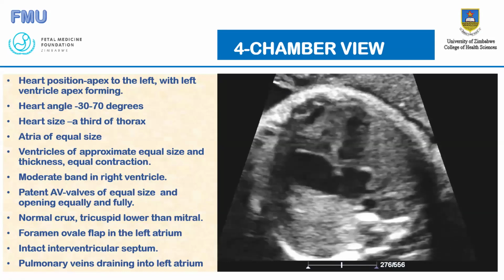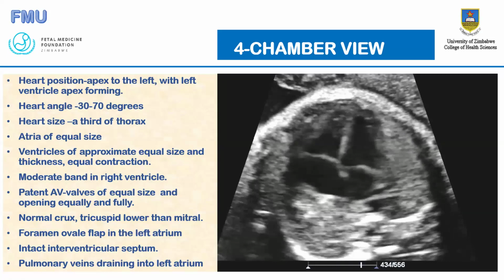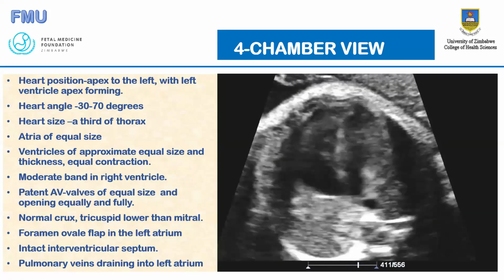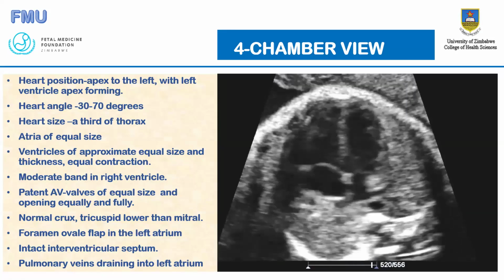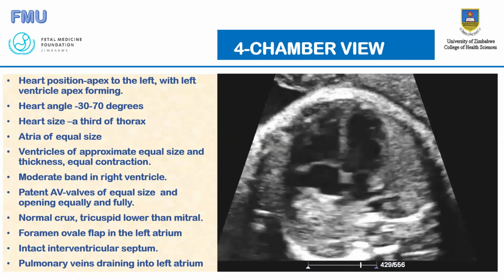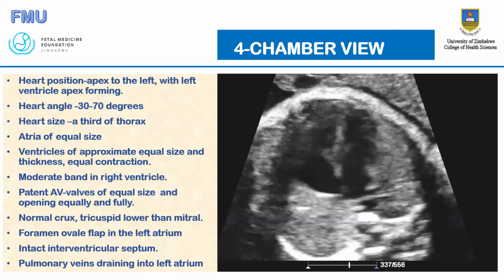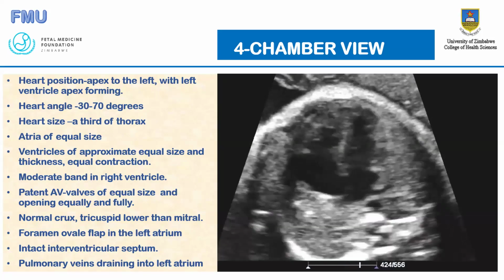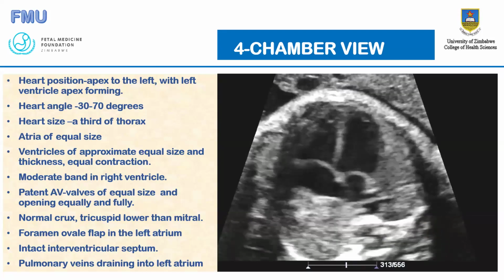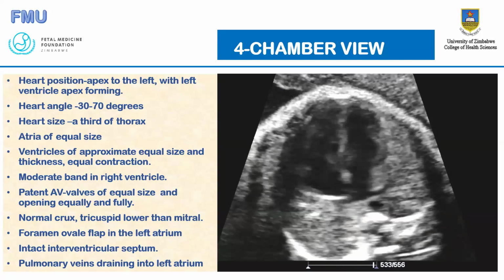So if you scan the heart using the OBS 2 and 3 settings, you may not be able to capture the opening and the closing of the heart valves. Why? Because the frame rate in those settings is on the lower side to capture the fast movement of the heart. So there is a reason why the cardiac settings are in the machines. It's so that you can examine the heart properly and capture the high frame rate that the heart examination requires. So please understand this. This is part of knobology and also the physics of ultrasound.